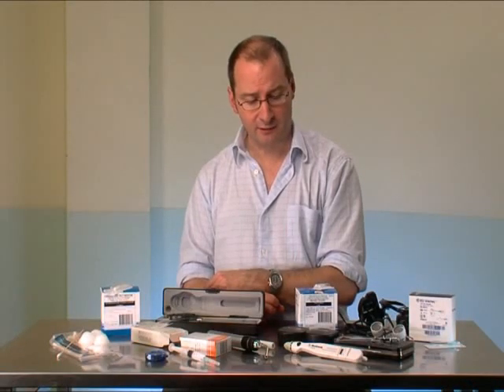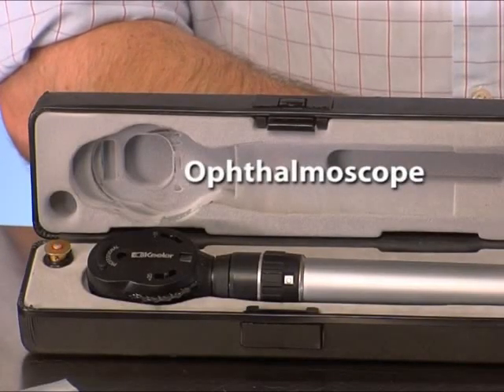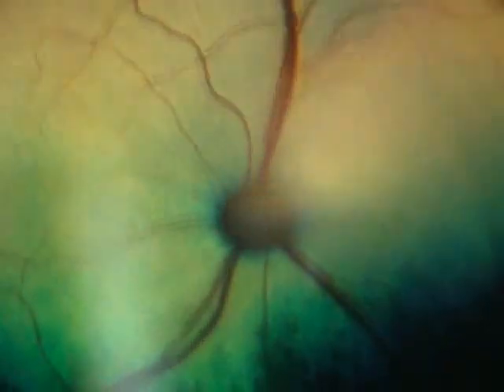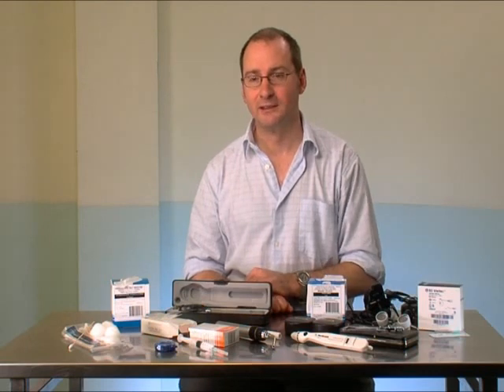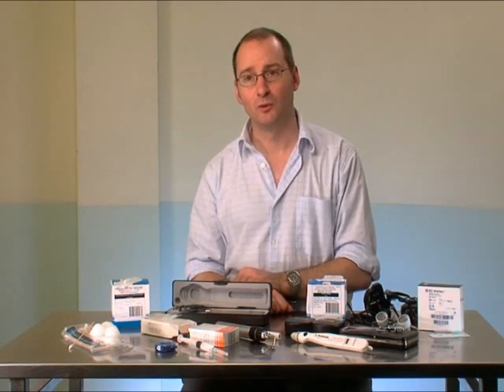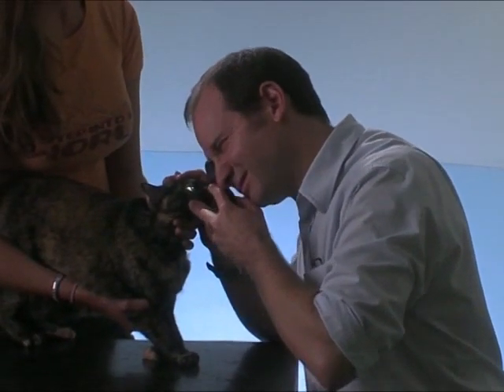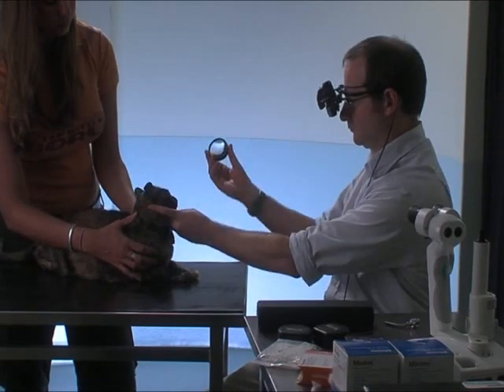Working deeper into the eye, we start to use the ophthalmoscope to assess the fundus, which includes the optic nerve head, the retinal vessels, the tapetum, the non-tapetum. It's very important to have equipment that will allow you to look through the lens. You will not achieve that with a simple pen torch. The main forms of ophthalmoscopy used in the veterinary field are direct ophthalmoscopy and indirect ophthalmoscopy. Each has certain advantages, and it's ideal to have access to both.